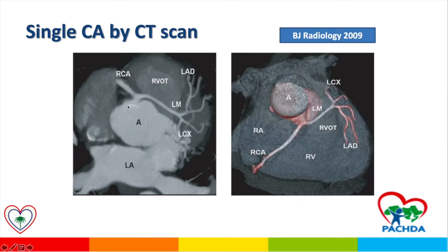This CT scan shows that this patient has a single coronary artery in which the right coronary artery and the left coronary artery are coming out of the same coronary artery. This similar view confirms that the left and right coronary arteries are coming from the same sinus.